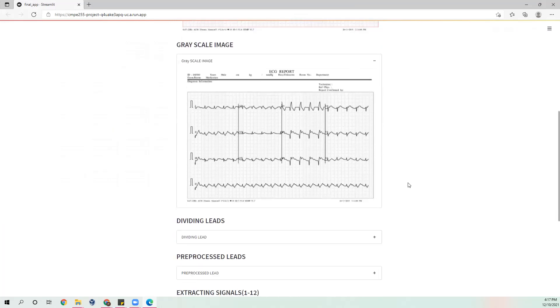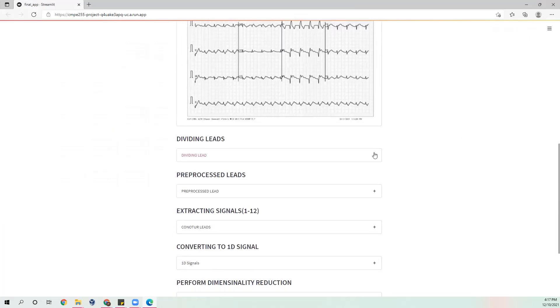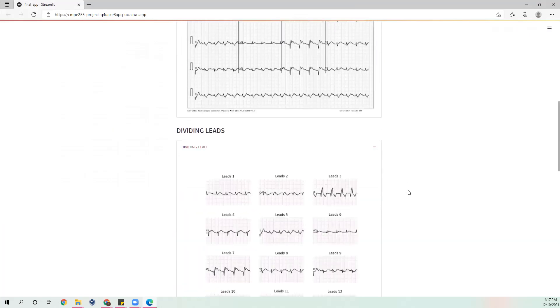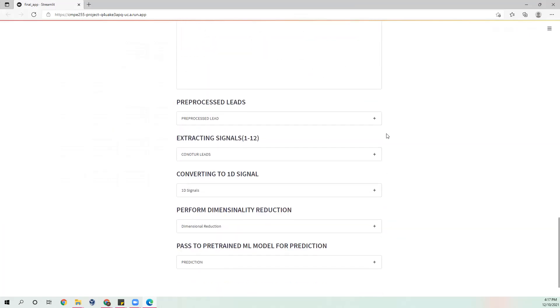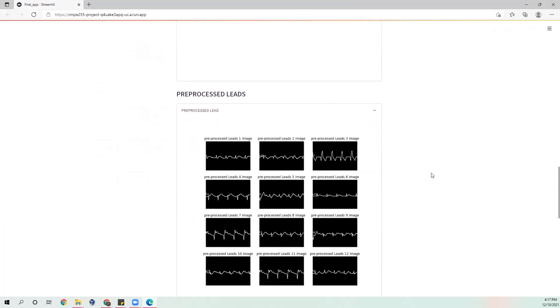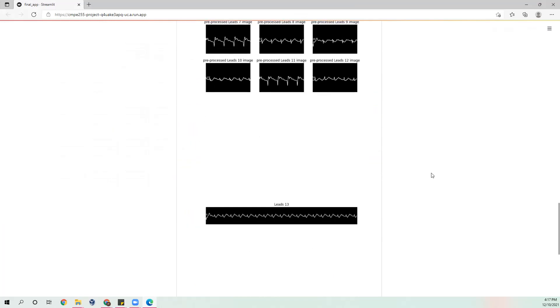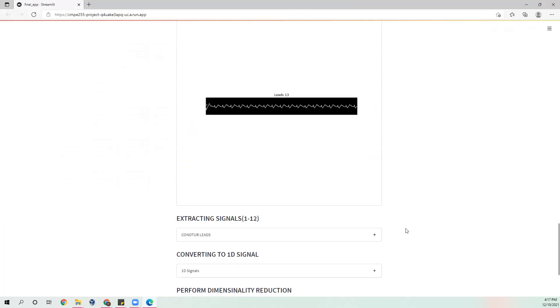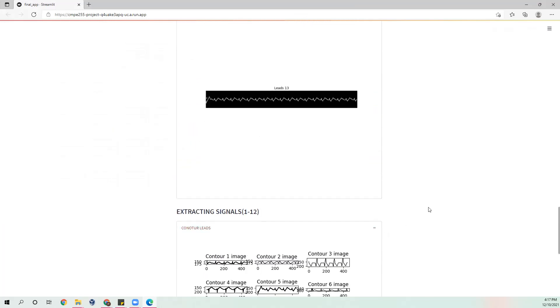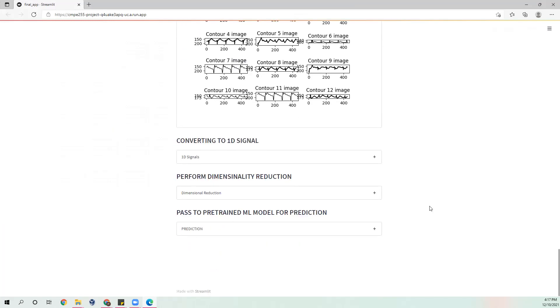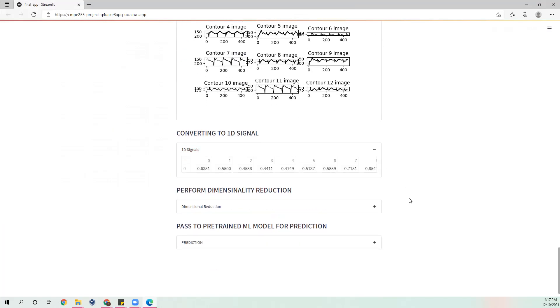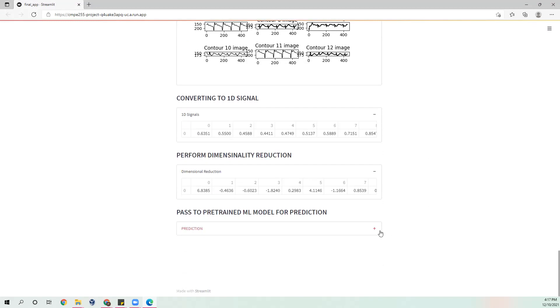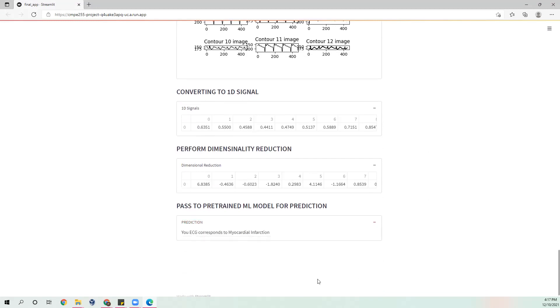Again, this is a grayscale image, then these are the different leads that we have, then our pre-processing steps. After dimensionality reduction, it says it's MI — myocardial infarction.